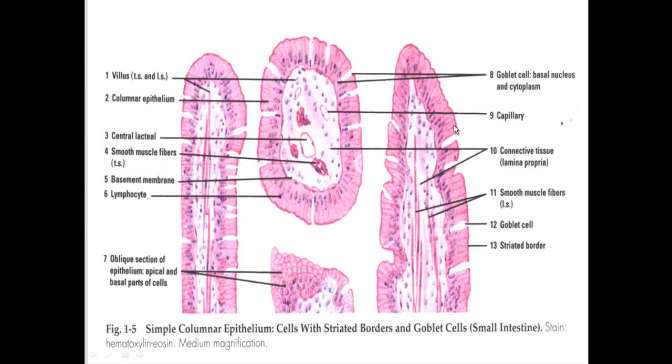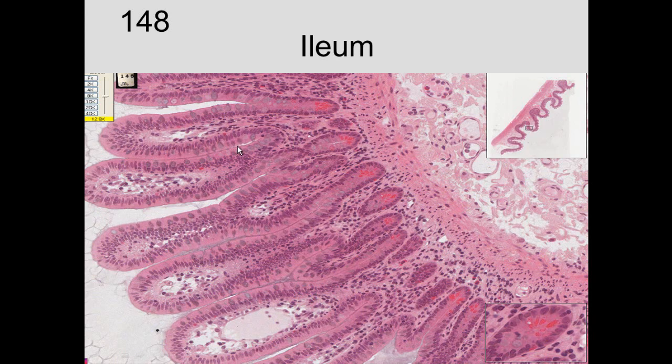We've got the connective tissue core in through here, epithelium on the surface, and this is where the epithelium absorptive cells are located. These are simple columnar cells, column shapes, with long nuclei in these cells, as we can see around through each one of these intestinal villi. Each has a series of intestinal absorptive cells which have goblet cells intermittently in there as well. Slide 148, the ileum, at a little closer magnification, we can see these intestinal absorptive cells and the goblet cells. We can see the nuclei of these cells kind of lined up. So these are simple columnar cells. We can see them right here. There's a nucleus, and there is a brush border that we see associated with the luminal surface.